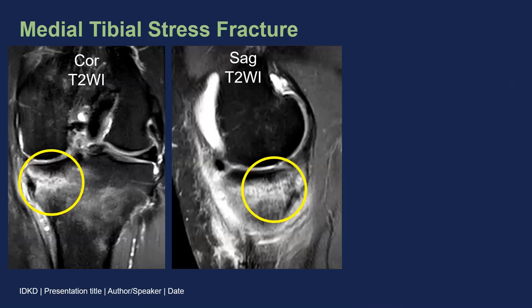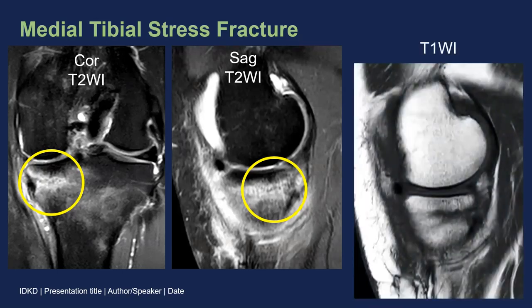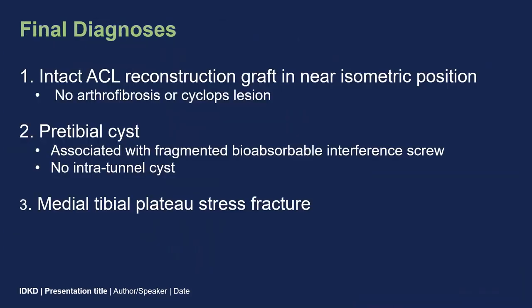The final abnormality in this patient — recall she also had pain in the posterior proximal medial leg — is a medial tibial stress fracture. We recognize this by referring to T1-weighted images, which are most specific for marrow abnormalities, and seeing a low signal intensity stress fracture line. In conclusion, this patient has an intact ACL reconstruction graft in near-isometric position, no arthrofibrosis or cyclops lesion, a pre-tibial cyst associated with fragmentation of the bioabsorbable interference screw with no cyst within the tibial tunnel, and a stress fracture of the medial tibial plateau.